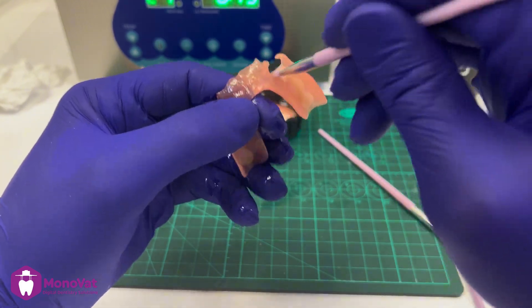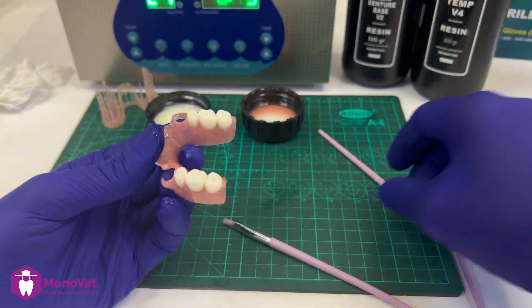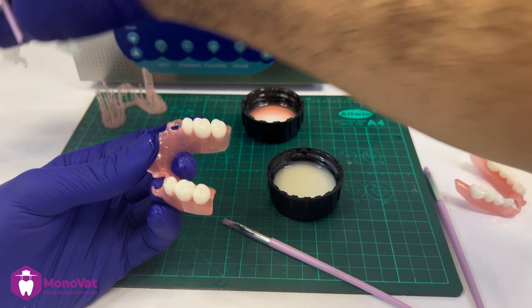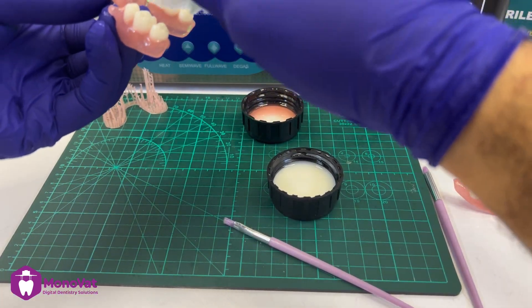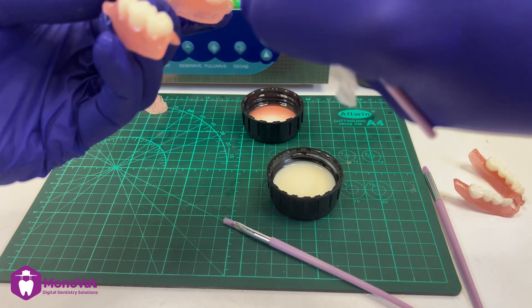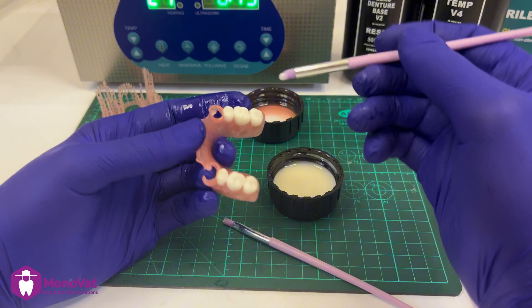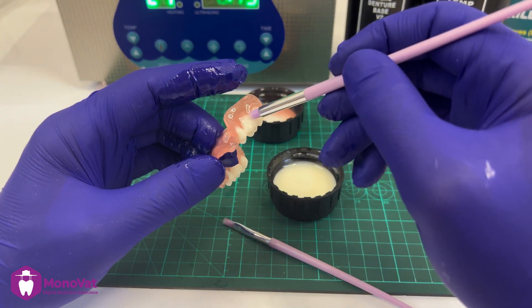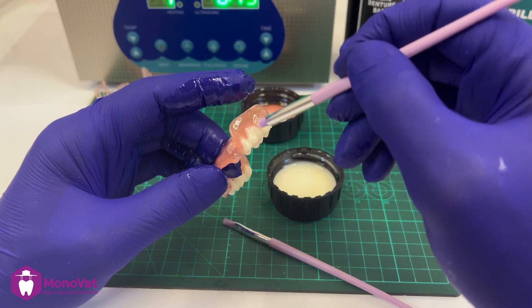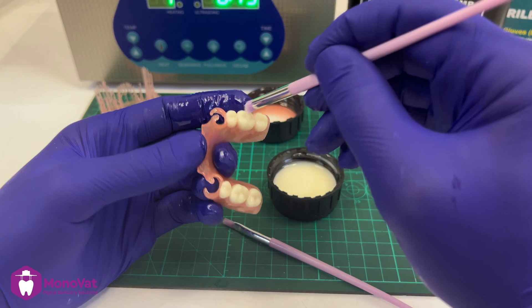This process protects the denture from color change, protects it from water absorption, and gives it a very nice shining view — so this is a very important step. For the teeth, I will add the same teeth resin as a candy coat. We should avoid a very thick layer as it's hard to cure in the machine, so add a suitable amount that gives a shining finish and coats all the teeth.